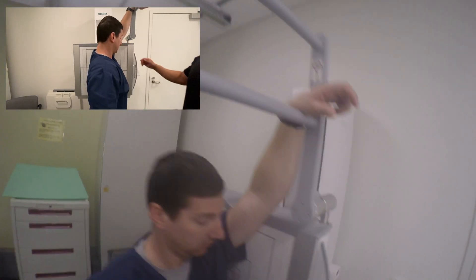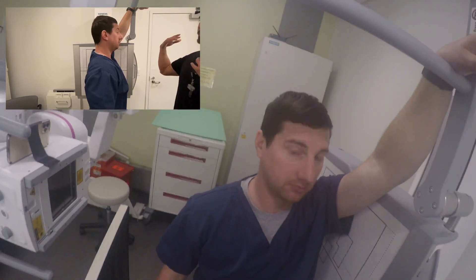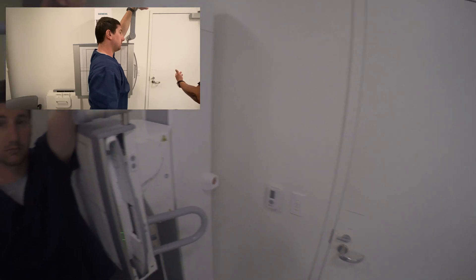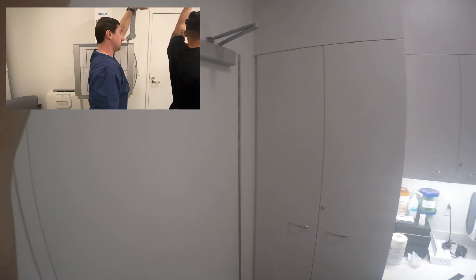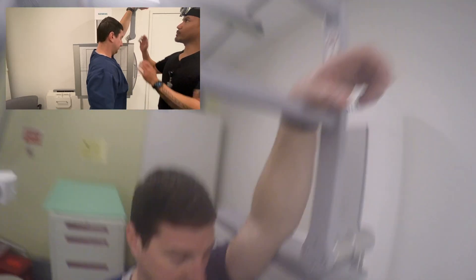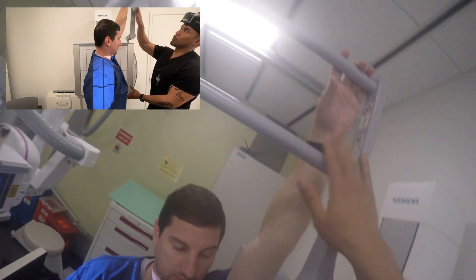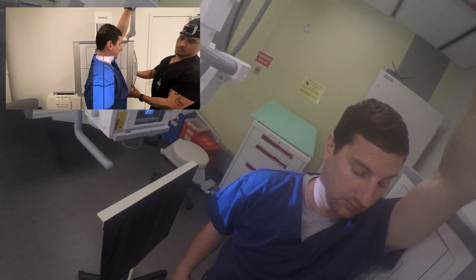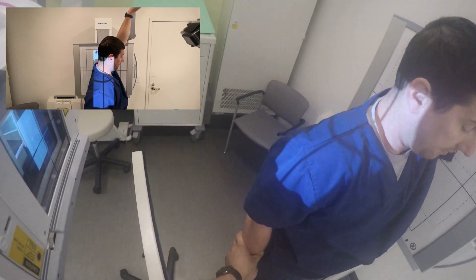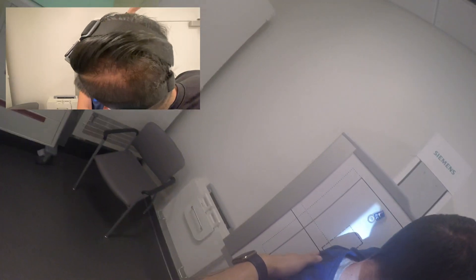Okay, good. So what I'm going to do is we're just going to kind of open up your shoulder joint there. Basically, if I'm going through your shoulder there, it's kind of too dense. So I'm just going to kind of open it up here, okay? So just leave your arm down to your side. Put your left hand on that bar. I'm going to lift this up a little bit, the lower one here. There you go. And then I'm just going to reach for your toes. There you go, kind of feel that stretch there.